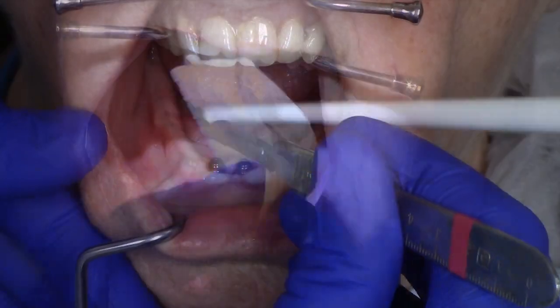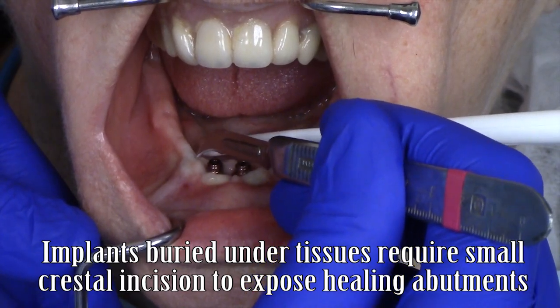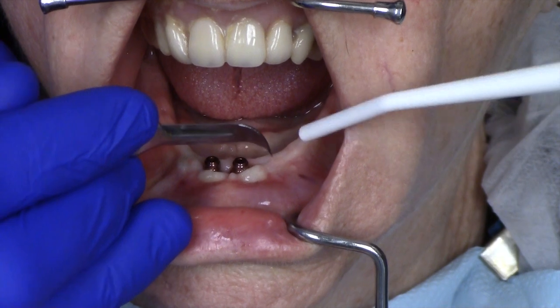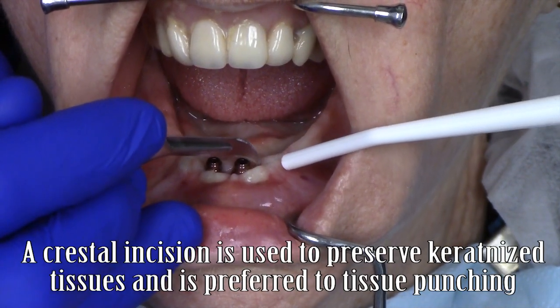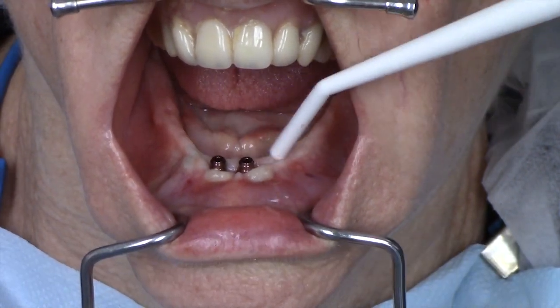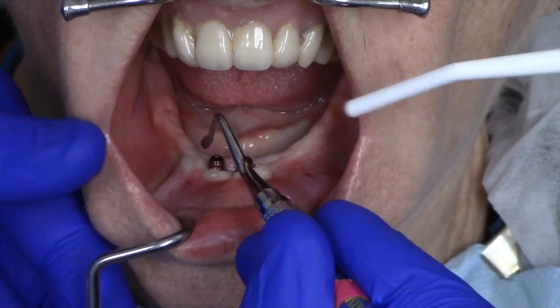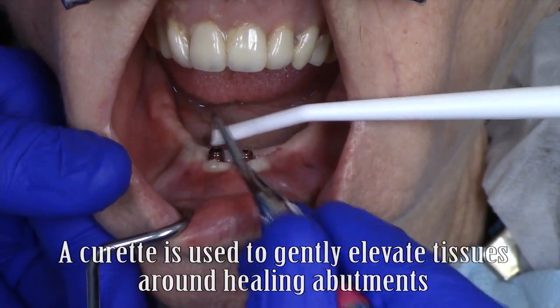For the posterior implants, the tissue was covering the implants and necessitated an uncovery procedure. Local anesthetic was applied to aid in this process so that the patient was comfortable. Crestal incisions were performed utilizing a 12 blade instrument. A hand instrument is best utilized to expose the top of the implant beginning at the crest, finding the metal portion of the implant — in this case, I'm using the back end of a dental curette.